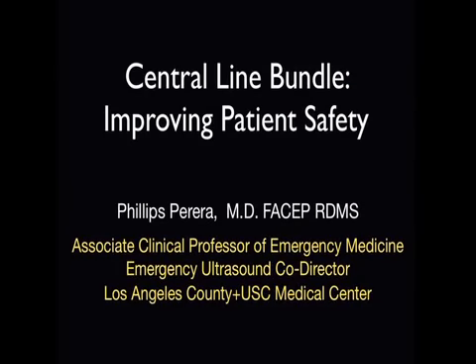In this Soundbites module, we'll discuss how we can improve patient safety through a concept known as a central line bundle. Now, the central line bundle is a six-step checklist of initiatives that can decrease both the infectious and mechanical complications of central line placement.